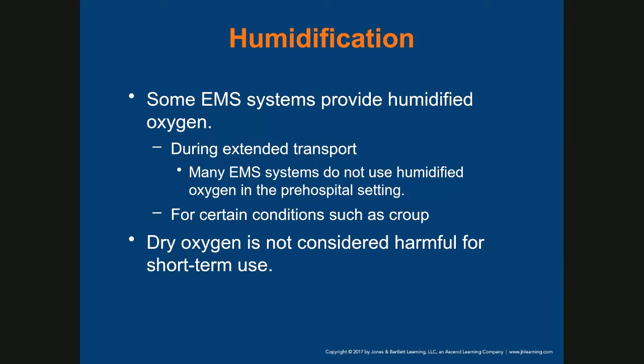Humidification, I've already talked about this one. Some EMS systems provide humidified oxygen during extended transport. Many EMS systems do not use humidified oxygen in the pre-hospital setting. However, as I said before, if you have a patient with a respiratory tract infection or airway burns, they will benefit from early humidification, right? Also for certain conditions such as croup. We're going to talk about that later on in the course when we do pediatric emergencies. Dry oxygen is not considered harmful for short-term use.